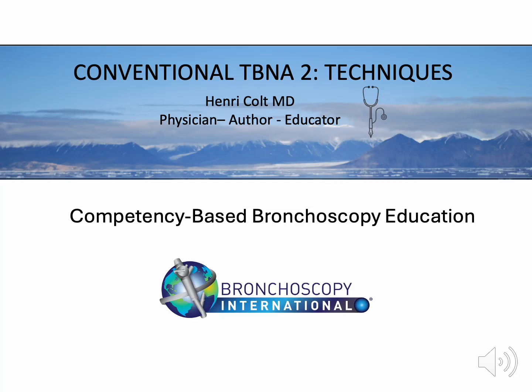I'm Dr. Henri Colt, and this presentation is part of Bronchoscopy Academy, an ongoing competency-based curriculum in flexible bronchoscopy. The goal of this work is to improve procedural understanding, anatomical recognition, and clinical judgment, while helping reduce patients' suffering associated with unequal expertise and inconsistent training.